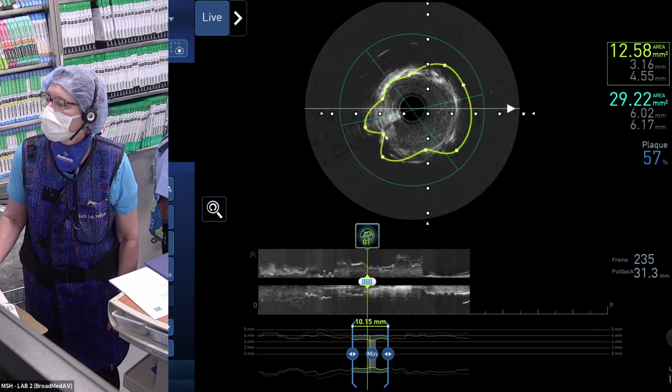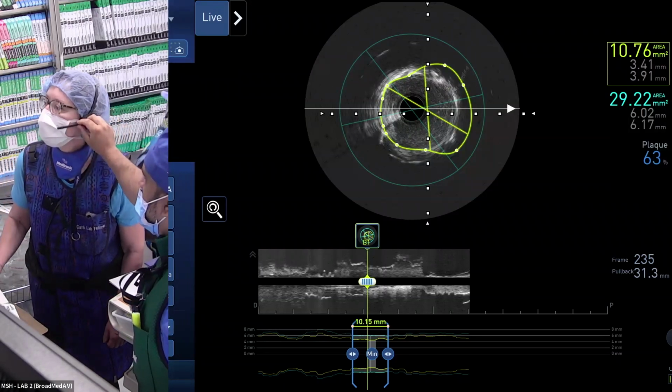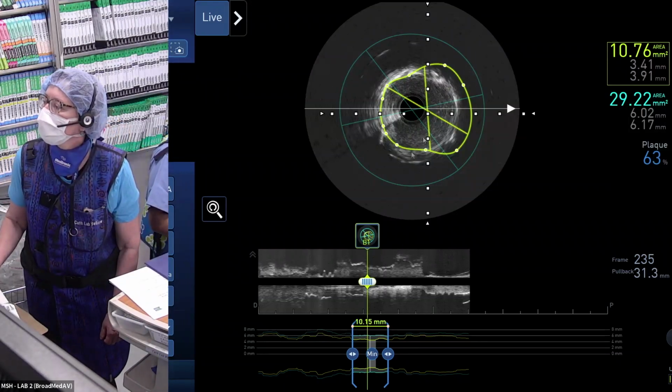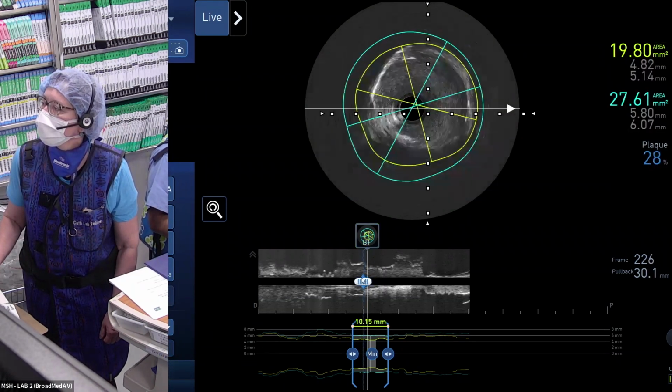So here it doesn't look like much lesion, but why? Angiographically there is a lesion. Are we exactly at that area? Can we see the lesion again? You want to take a good picture again? You do a dry cine once, to see how much calcium it is. Take a better picture. It was not a good picture that time.